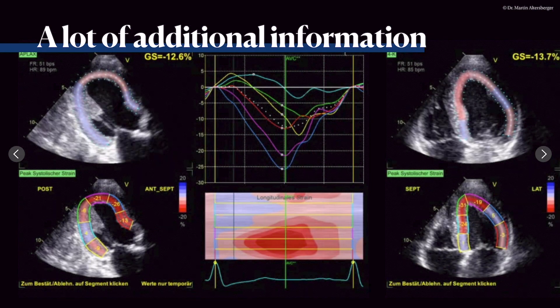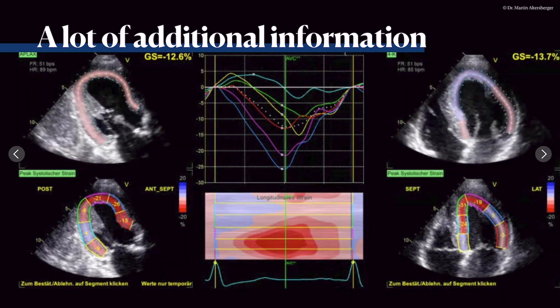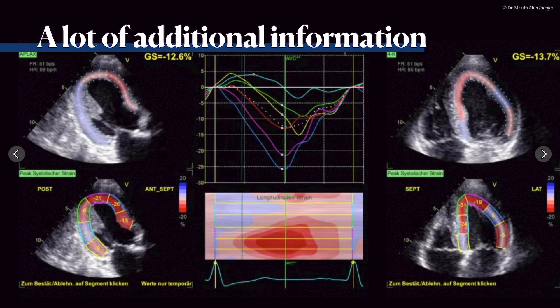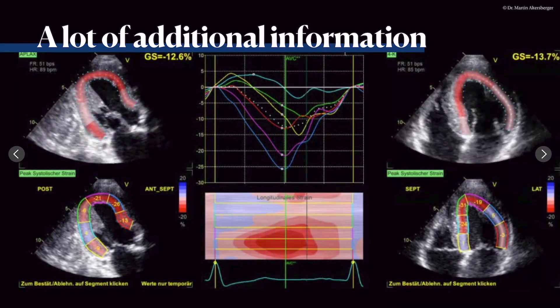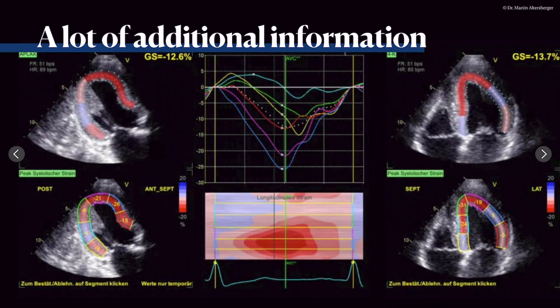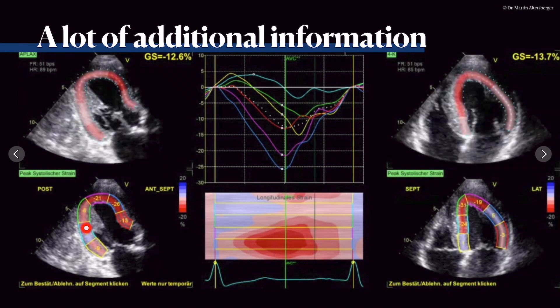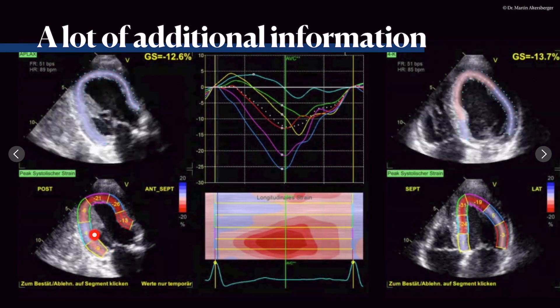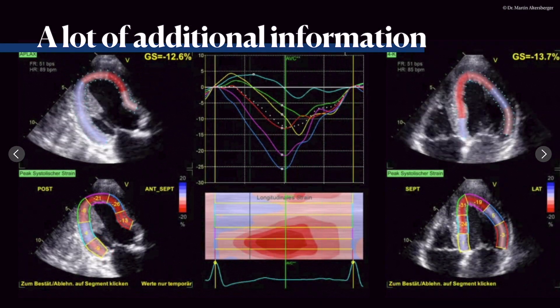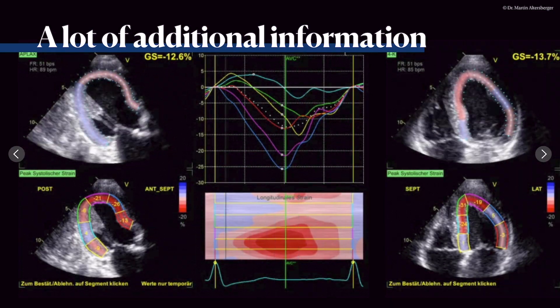One last thing I want to mention is strain imaging. Strain imaging holds a lot of additional information in cases of valvular pathology. Here you can see that there are some regional problems — the thickened myocardium leads to a reduced longitudinal strain.